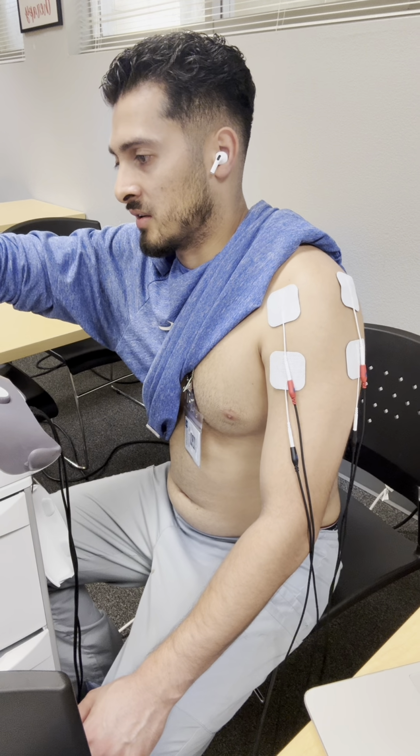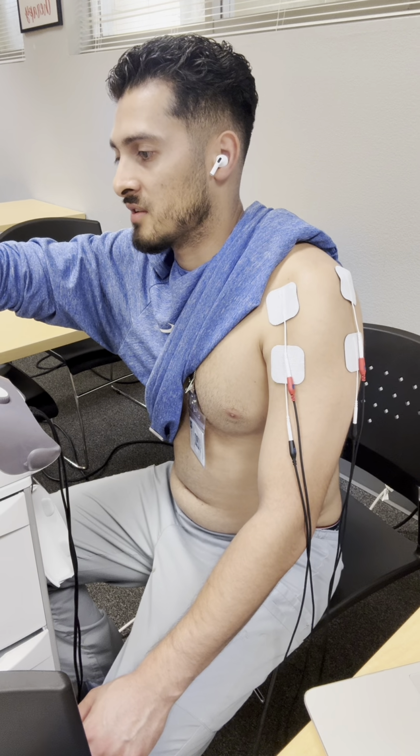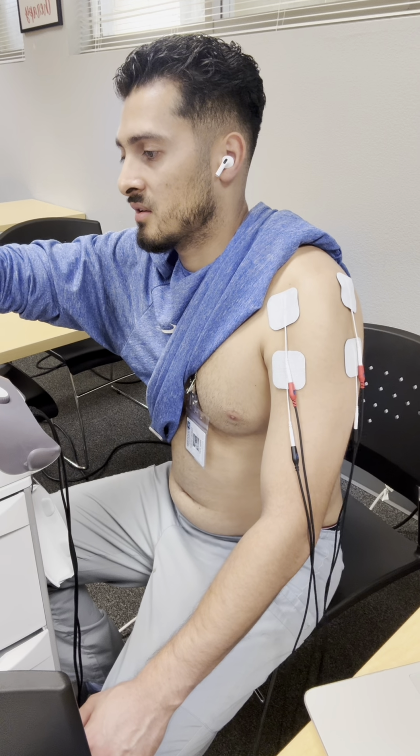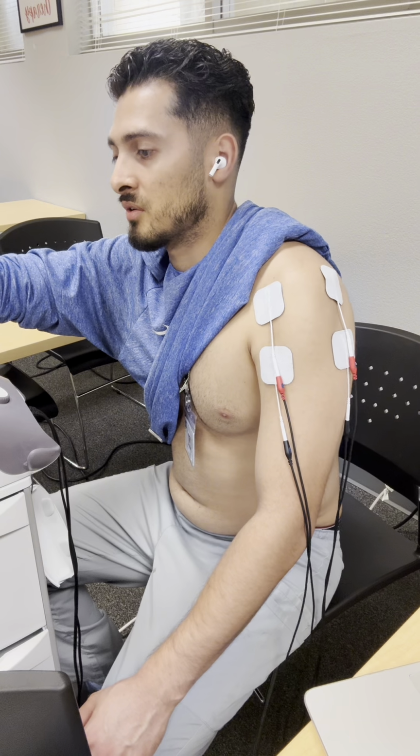I think for the most part, there we go, I'm taking it back to 45 so that it's evenly distributed. That seems to be the best option there. Makes the deltoid work like crazy.